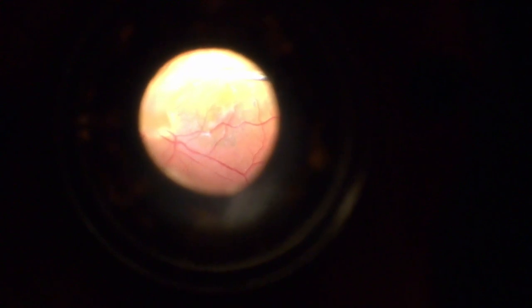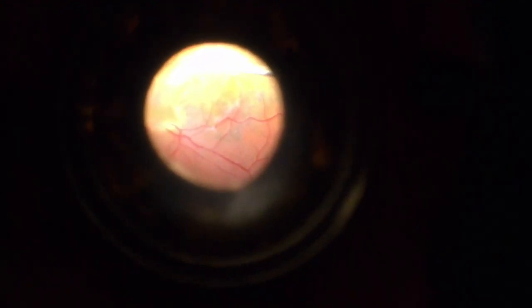Actually, we just need something to make an edge. So these, we have several in the sets that I know are broken, and I don't think the surgeons mind, because it's, again, just trying to get an edge going. And you kind of got one already there. See that?